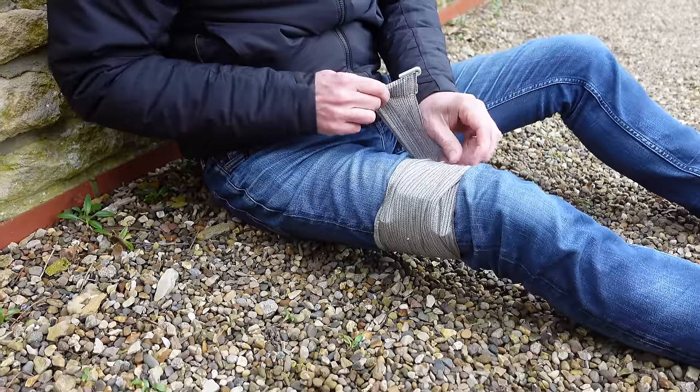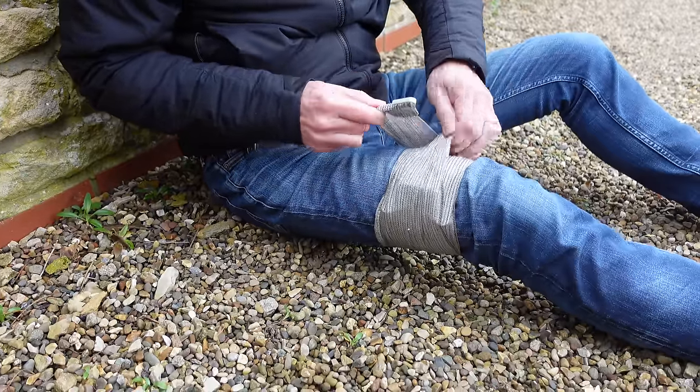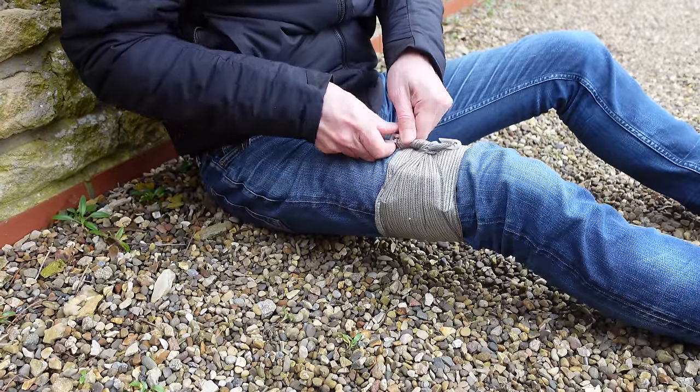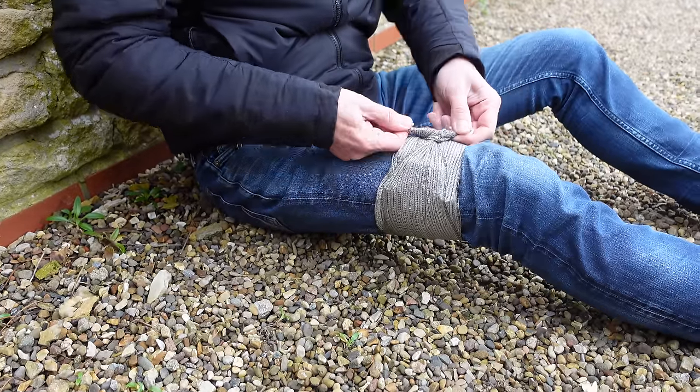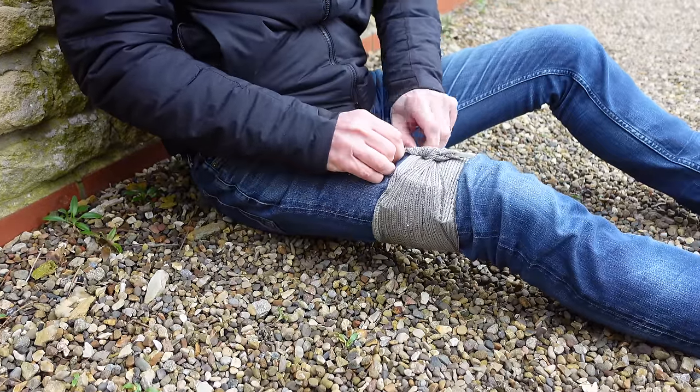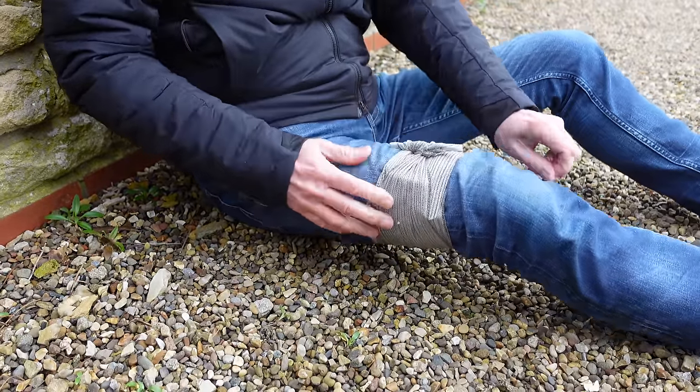There's one more thing you can do with the Israeli bandage: if you place the pressure bar under some of the layers and twist, you have a makeshift tourniquet with the bar acting as a windlass. It's not a direct replacement for a purpose-made tourniquet, but it is a useful feature in an emergency.